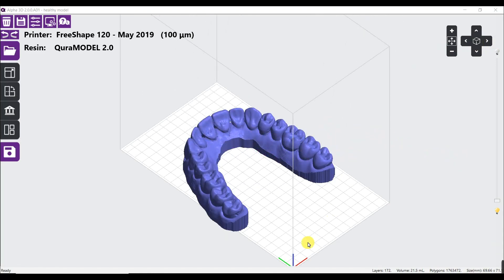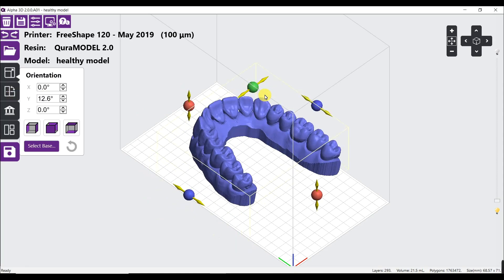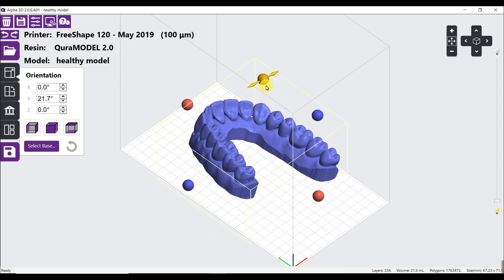Lastly, I will check if the print can fit into the printing area. If not, it will be in blue color. In that case, we can try to change the orientation. And once that's done, we can add support.